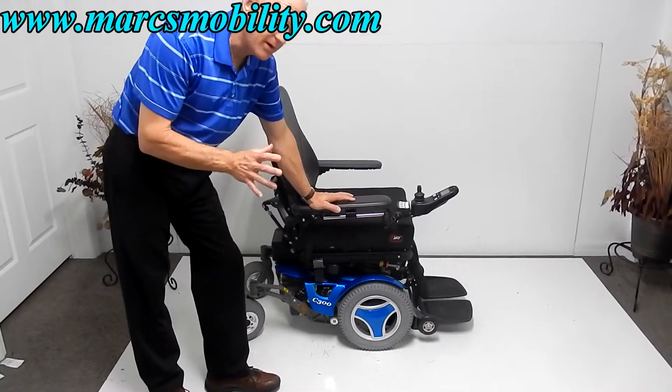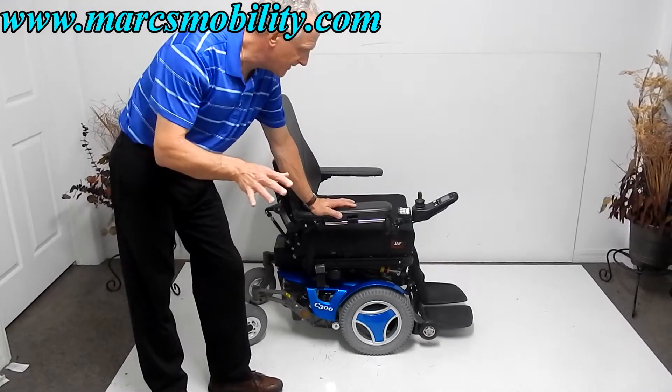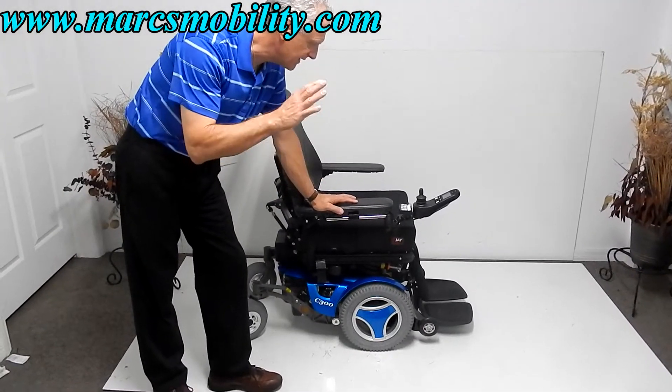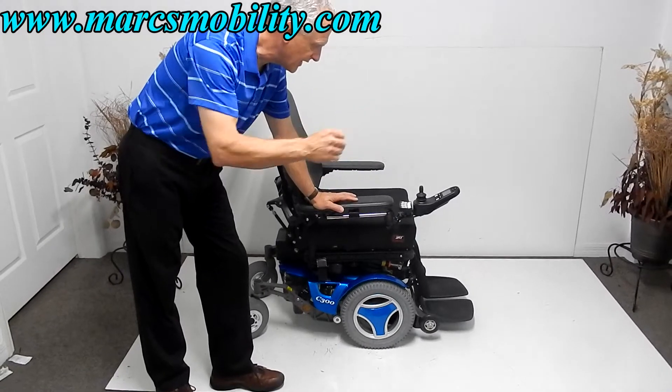This is a Permobil C300 power chair, and it is fully loaded. It has an 8-inch seat lift, electric tilt, electric recline, and the legs are electric.